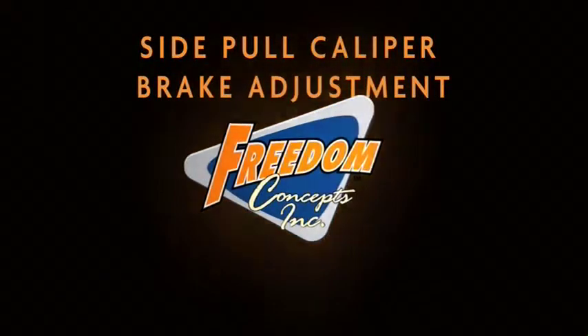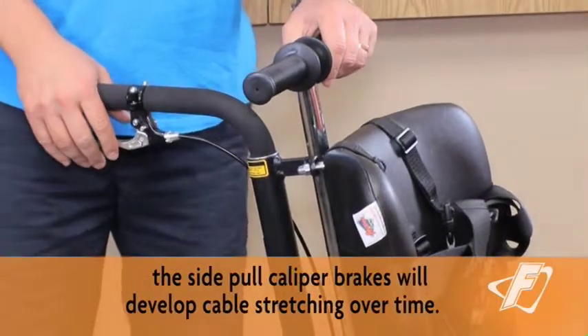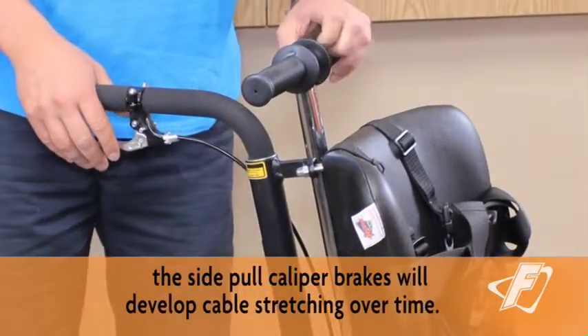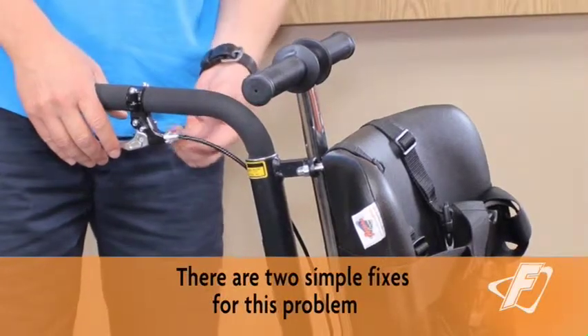Side Pull Caliper Brake Adjustment. Typically on the Discovery Series bikes, the side pull caliper brakes will develop cable stretching over time. There are two simple fixes for this problem.